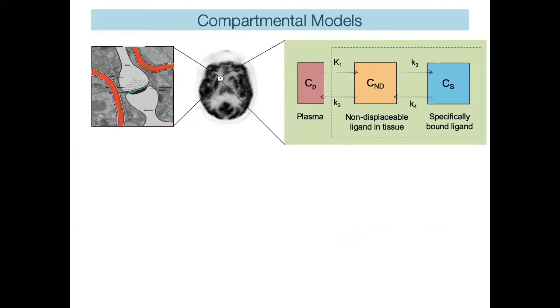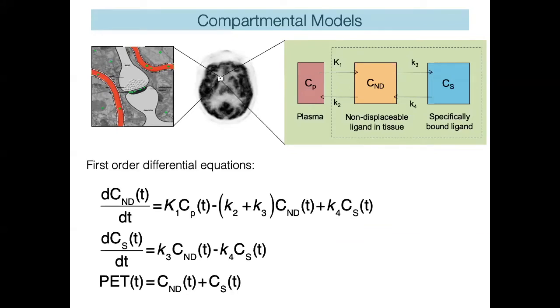When we have these compartmental models, the way we describe them is that you can use the law of mass action in order to describe them as first order differential equations. Again, I'm not going to go into details of this, but I just want you to understand that's how we mathematically describe a compartmental model, in this case the example above.